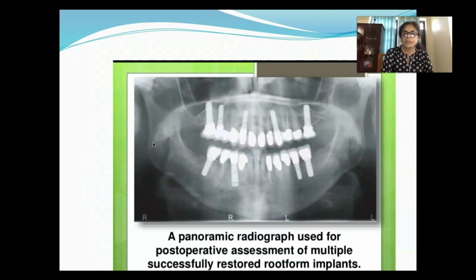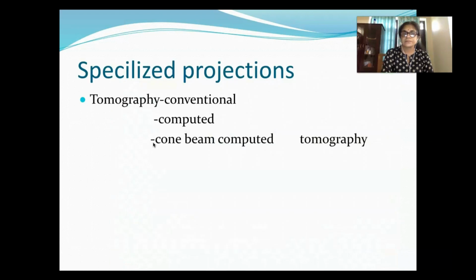This is a panoramic radiograph used for post-operative assessment of multiple successfully restored root form implants. You can see so many implants are placed, and for that reason an OPG is required.